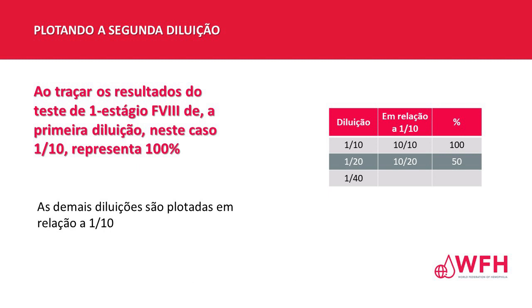So for the standard, 1 in 20 dilution, 69 seconds, 70 seconds. Very close. Take an average, 69.5. 1 in 20 dilution, 50% line, 60, 2, 4, 6, 8, 69.5. Of course, it's just beneath the 70.